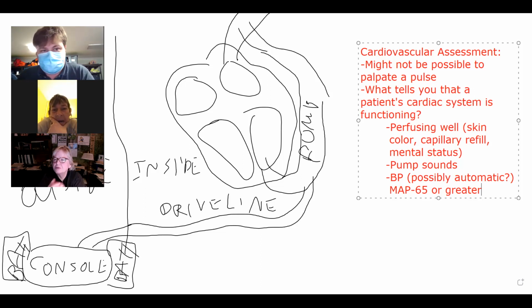Tyler, would one of those over-the-counter wrist cuffs that are self-inflating and automatic work, as opposed to the traditional pump it up and release the air that we normally do in the field? I think in general, home use automatic blood pressure cuffs are subject to a lot of user error.